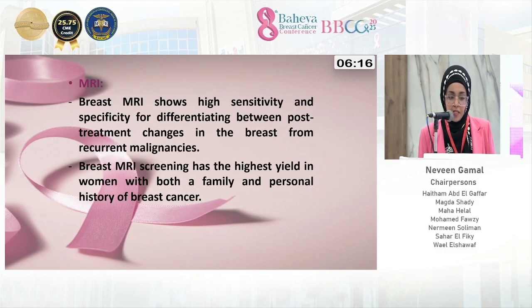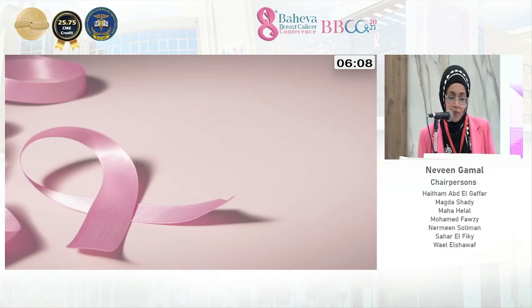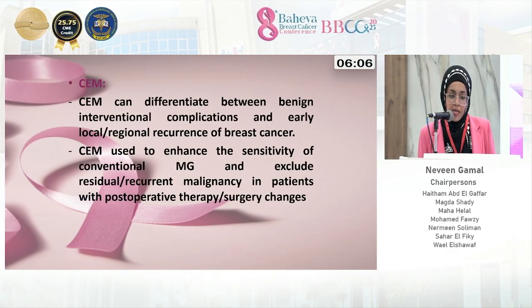MRI shows high sensitivity and specificity for differentiating between post-operative or post-treatment changes in the breast from recurrent malignancies. And contrast can differentiate between benign intervention complication and early local regional recurrence of breast cancer. It's used to enhance the sensitivity of conventional mammography and exclude residual or recurrence malignancy in patients with post-operative therapy or surgery changes.